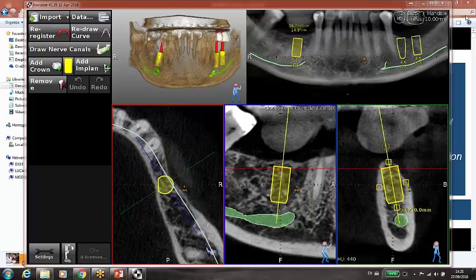The question is that if it probes you to do it manually, you should always ask why. Because it might be possible that the CT that you're uploading is not a good one because the patient has moved, or, for example, the fiducials were dislodged while scanning, and therefore they do not lie on the same plane, but lie transversely on different planes, and that's the reason why it cannot match the fiducials with the DICOM files. So you should always pay attention to the reason why it cannot do it automatically, trying to be critical of the CT data and trying to really assess why.